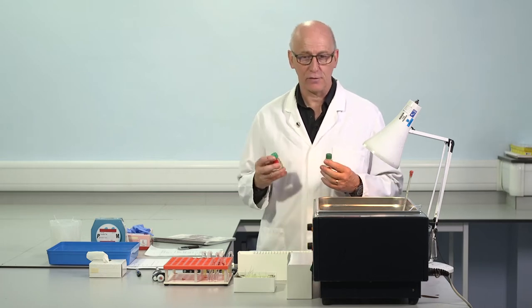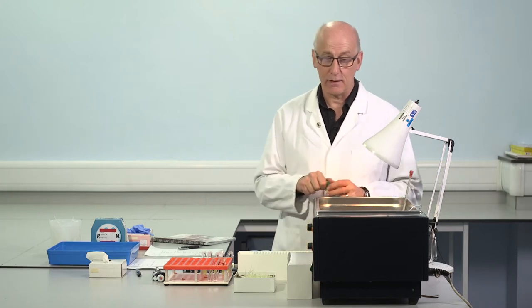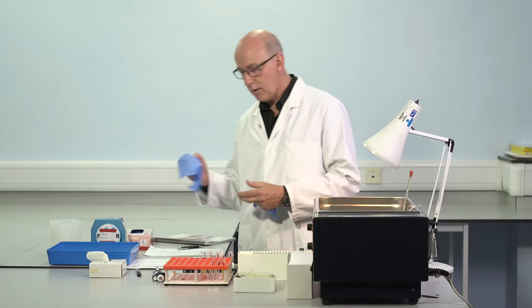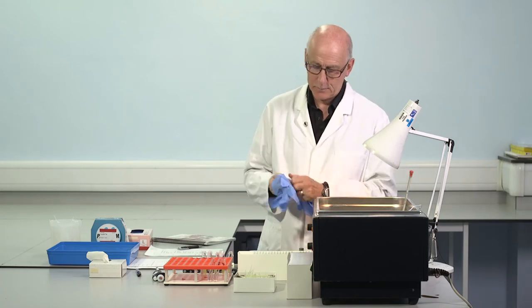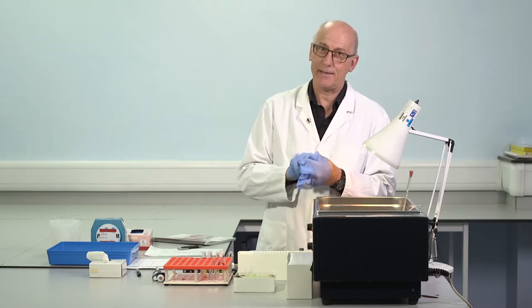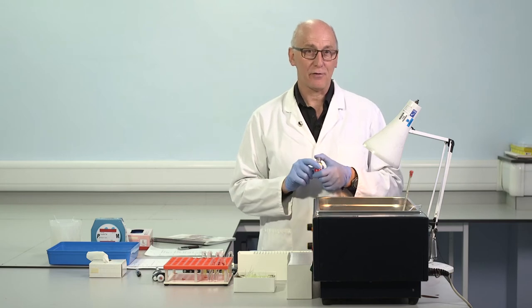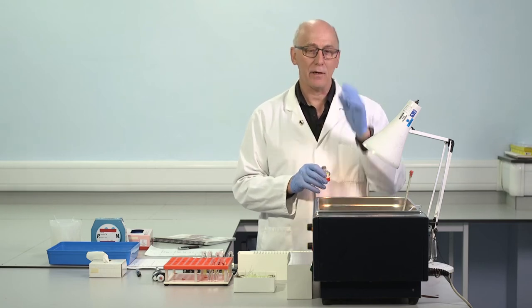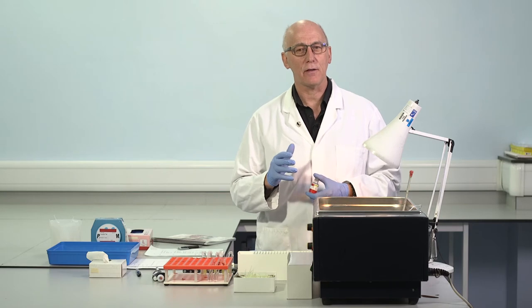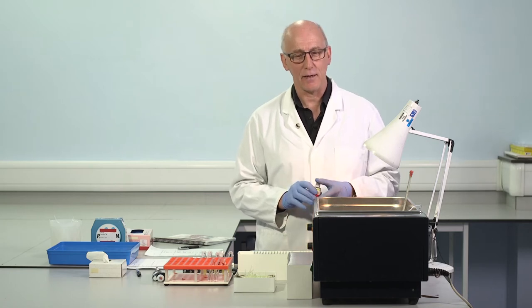We'll be using two different reagents, and these have different phospholipids and different activators. We'll be running these tests in the water bath. So the first thing I need to do, once I've put the gloves on, is to put out some APTT reagent into the water bath to be warming. And of course, when we move a reagent from a primary to a secondary vial, either in the water bath as we're now doing, or on an autoanalyzer, we have to pay attention to the fact that we may have altered the stability conditions. So we need to use the reagent during its period of stability in its secondary vial.